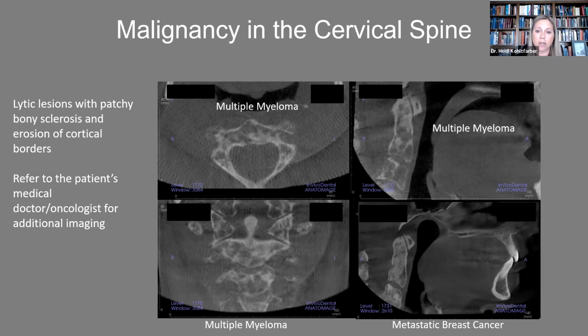Again, people did not go to their doctors over the last 2 years. And so I think us as dentists, we've always been part of the medical community, but with this technology we're definitely much more involved, much more of a team player than we even were before. And our medical colleagues are really seeing that as well. So we've seen some real nice collaborations with that.